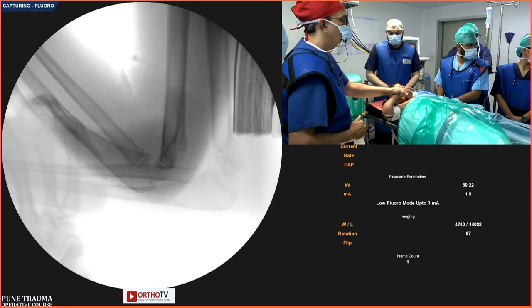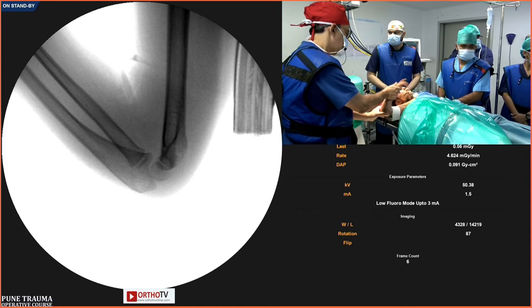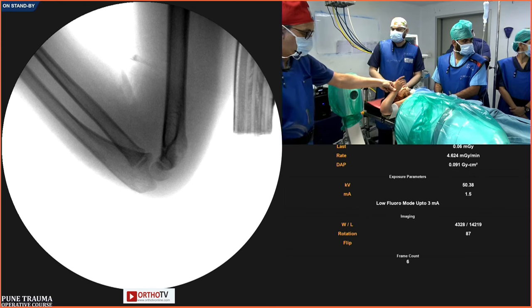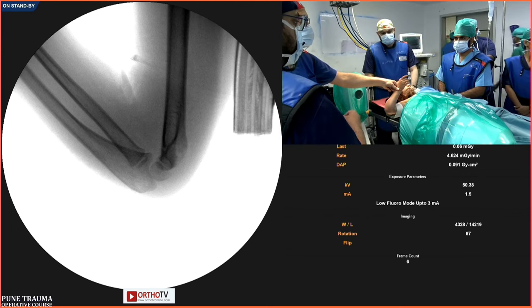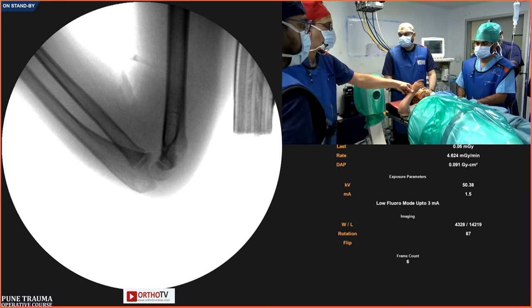So I'm just going to show the anterior humeral line here. Can you see the reduction? Now it goes through the center of the capitulum. Can everyone see that? Previously, it was going anterior to the capitulum. Now it is going perfectly through it. So what magic did you do, Sandeep? I just flexed it acutely.